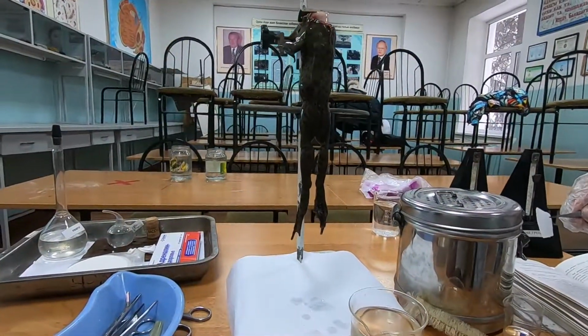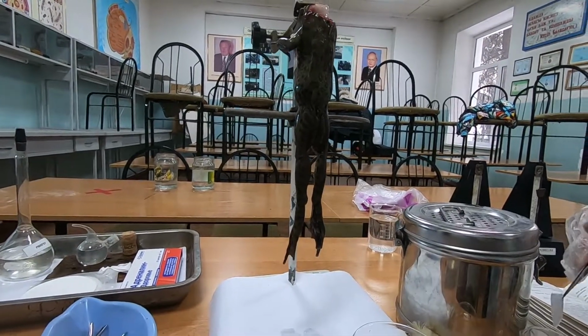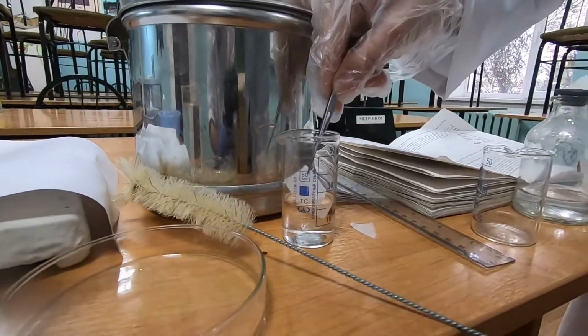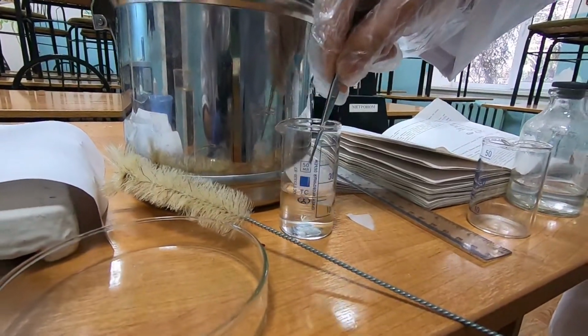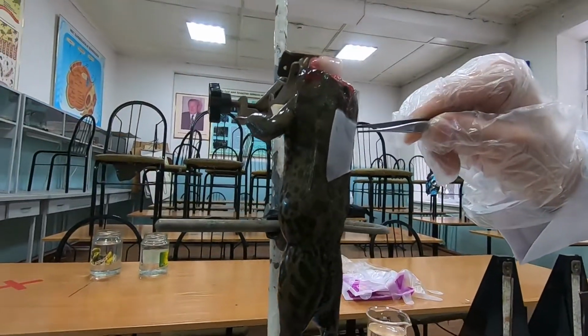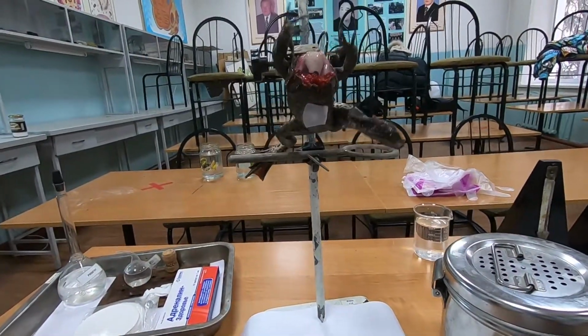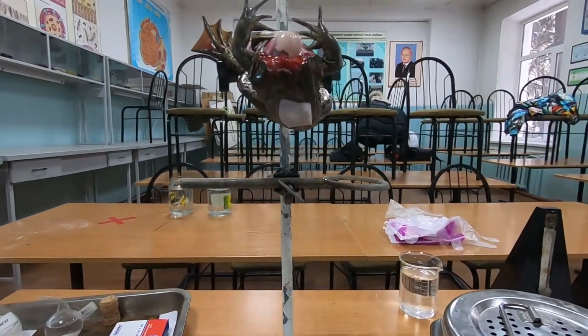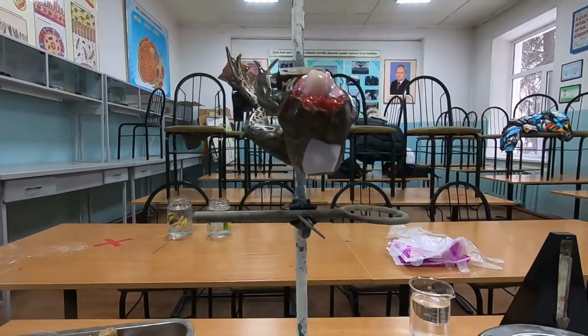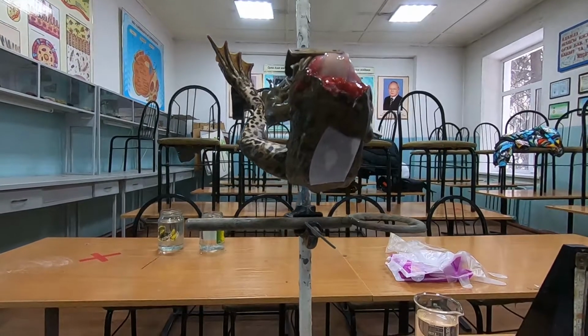Now, the next point is we're going to apply it on the spinal cord. Put it and leave it there. Okay. Remove it.